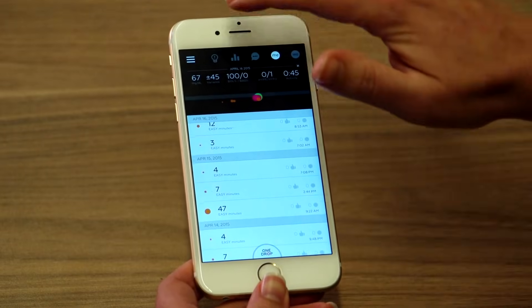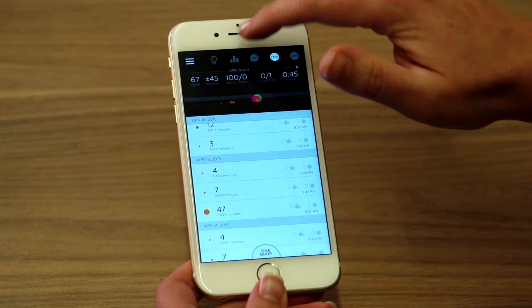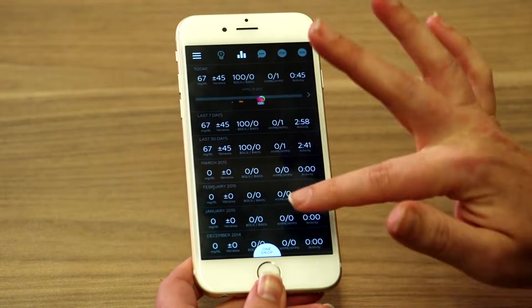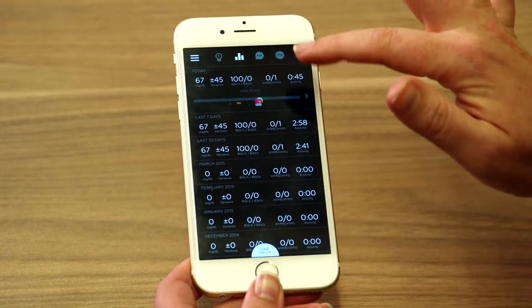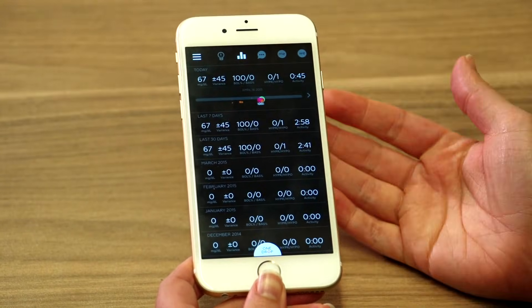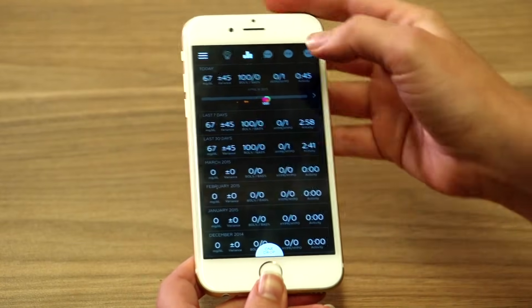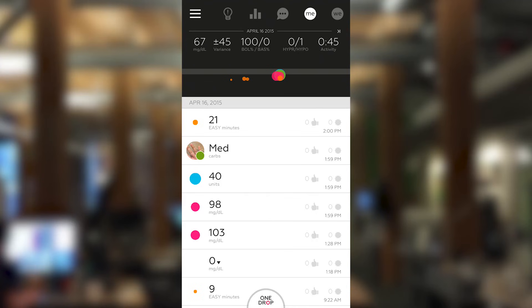It's able to give me a picture over time about what's been going on within my body and why my insulin might be high or low or several different things. You can go into the Me section where it has a running log of everything that's been going on with you that day.